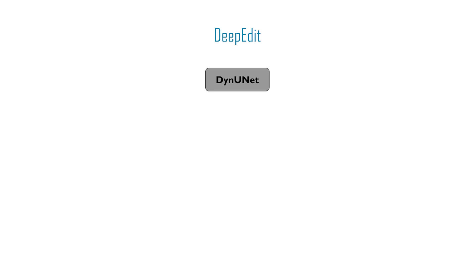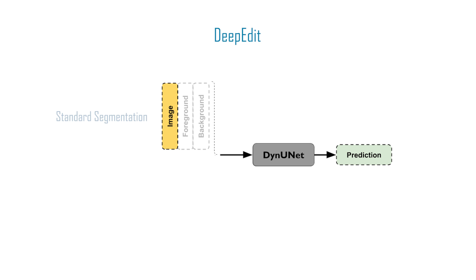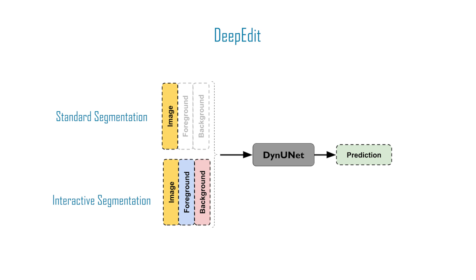DeepEdit combines the power of two models into a single architecture. It allows the user to perform inference as a standard segmentation method and interactively segment part of an image using clicks.